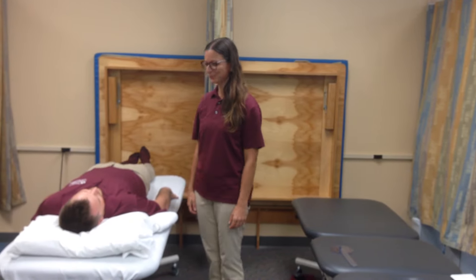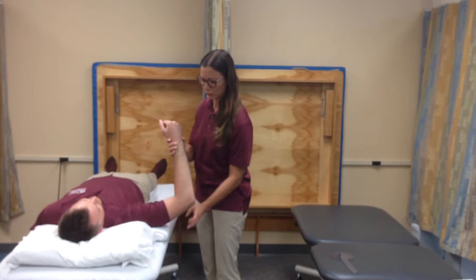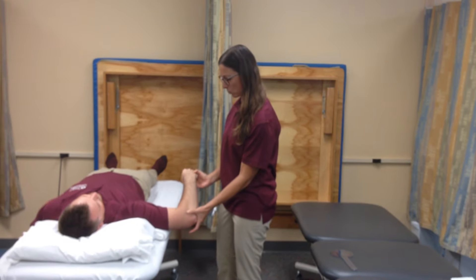Good morning, Anton. How are you? Today I'm going to measure your range of motion of this motion.